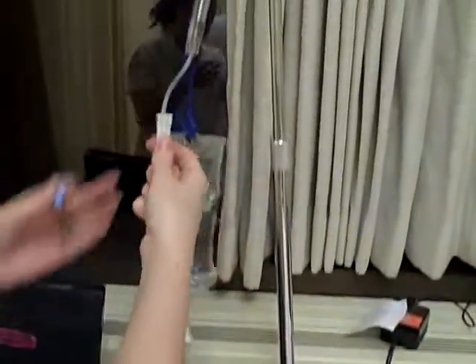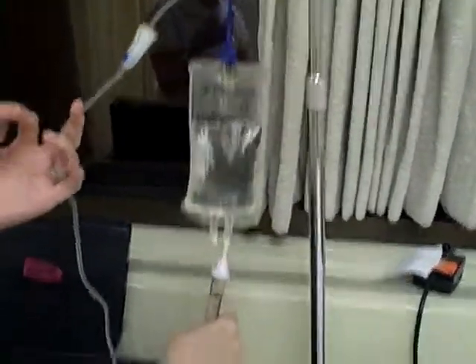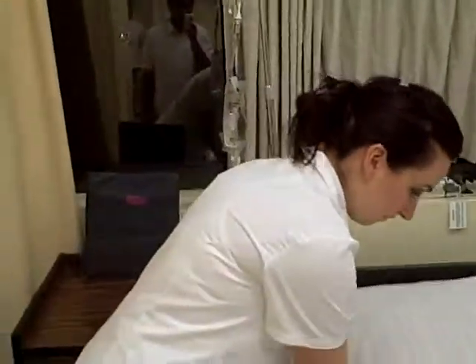Then I would unlock this and make sure everything's flowing and that it is regulated through the primary. Then I'm just going to document everything I did and wash my hands.